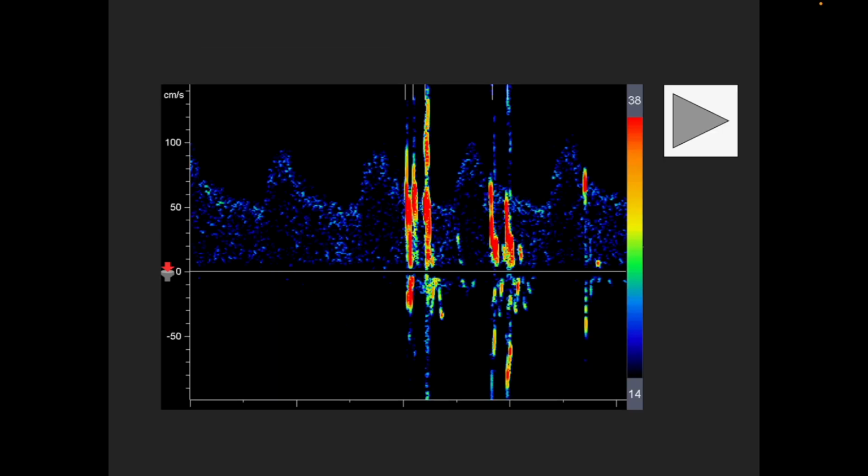However, for very low or very high dB values, it is very likely that we look at either particulate or gaseous emboli. In this case, we have at least 6 microembolic signals in the Doppler spectrum. The first 5 ones are so intense that they distort the signal and are even visible beyond the FFT. It is hardly conceivable that such strong microembolic signals are caused by particulate emboli. You can listen to the signal by pressing on the gray arrow in the right upper corner.